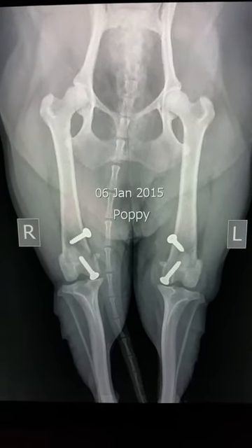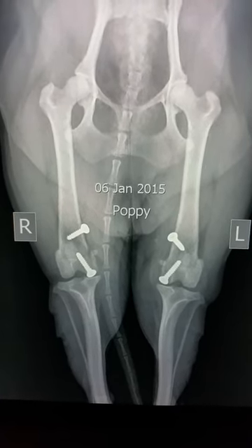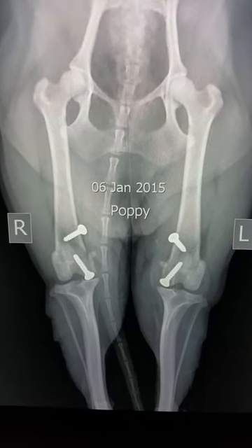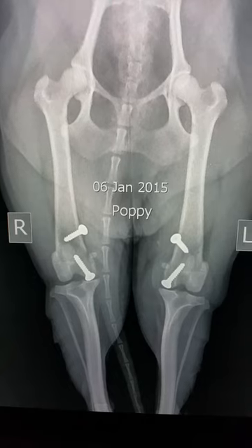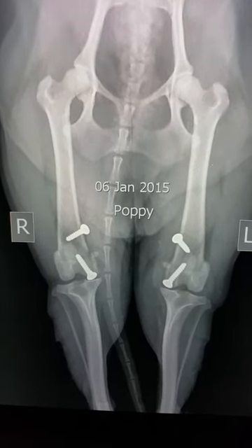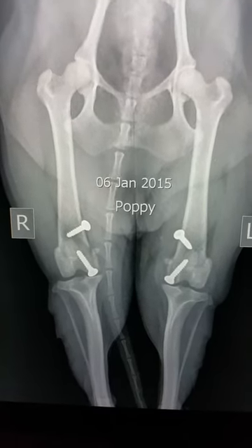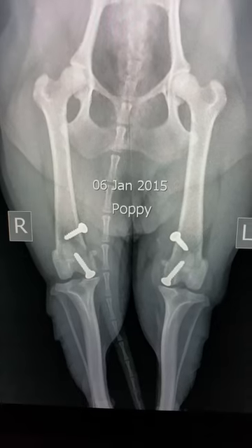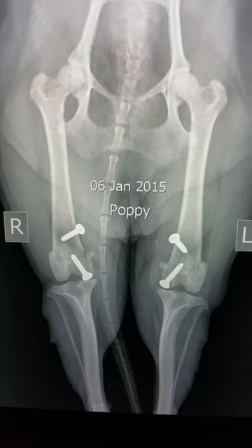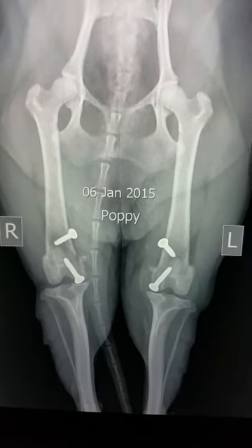This is post-operatively — right and left REACH-TOP, size 1.5 centimeters, inserted and implanted on both stifles. On the medial side, a medial arthrotomy was done and both REACH-TOP implants implanted using 2.7 millimeter screws.